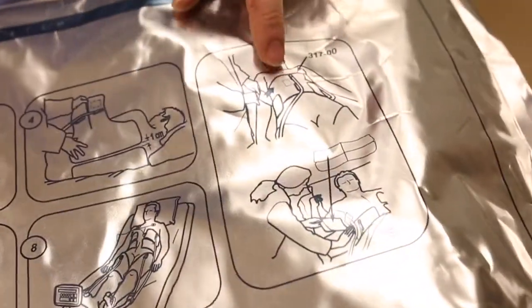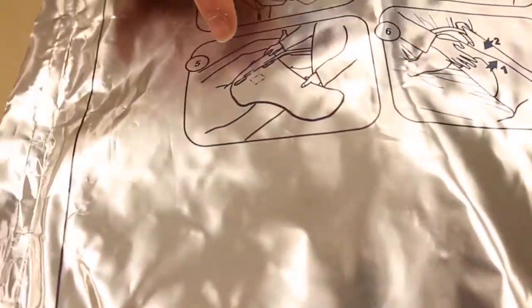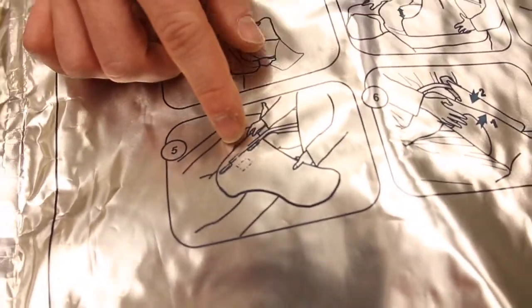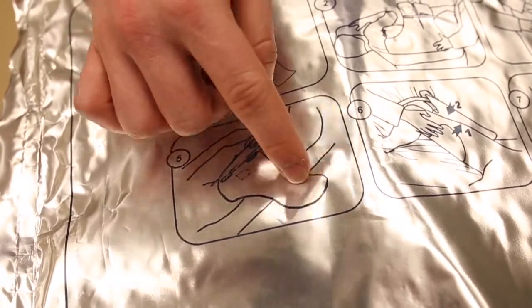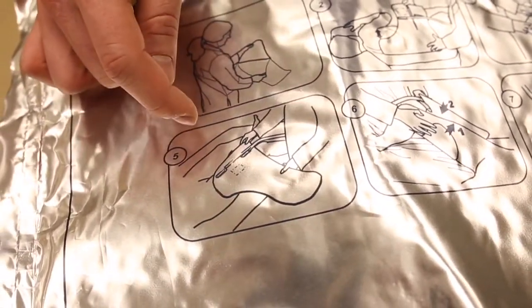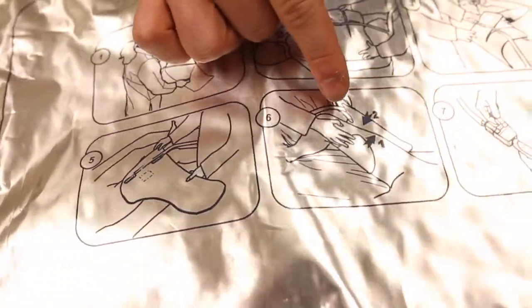You can put defib pads under the Arctic Sun pads - that's fine. Then do the thighs. The thigh pads are a little different; they don't have the separator in the middle like the chest pads do. You'll put them on the same way.